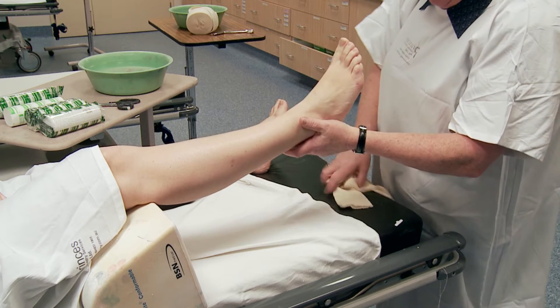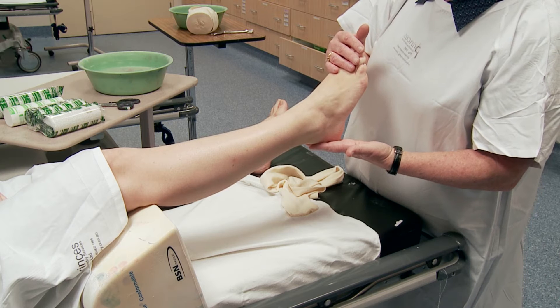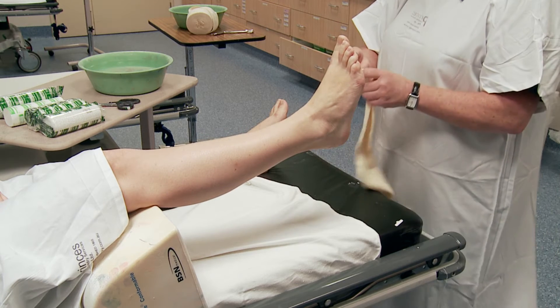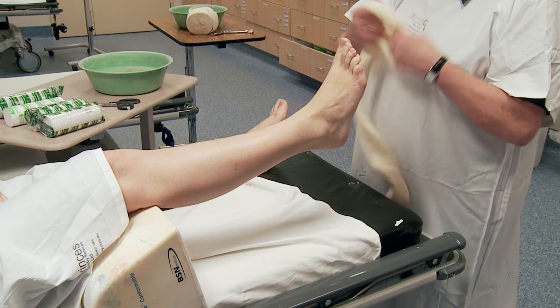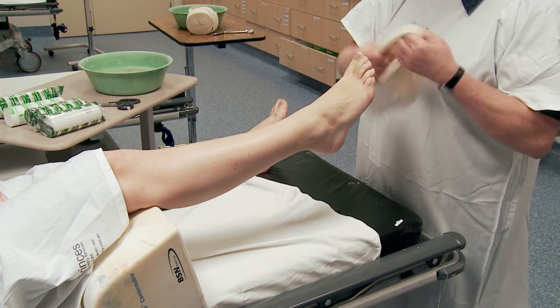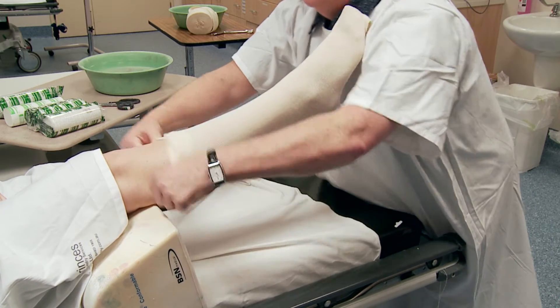It will make it easier for your rehab when you come out to have it at 90 degrees. If you leave it like this and you come out of the plaster, it's too hard to put your foot back to 90 degrees. If you did your Achilles, then it would be relaxed and every two weeks it would go back. But because you've got a Weber B fracture, which is a normal standard fracture, we're just going to do this.